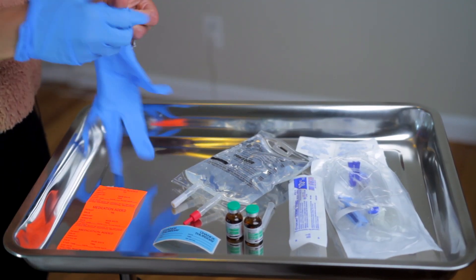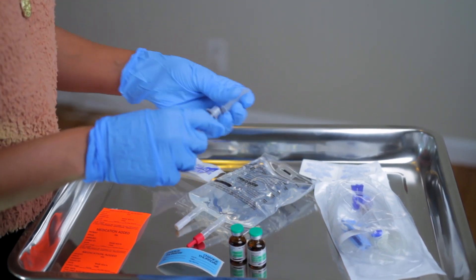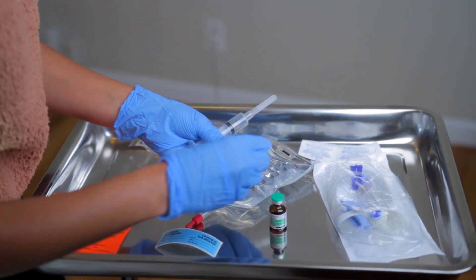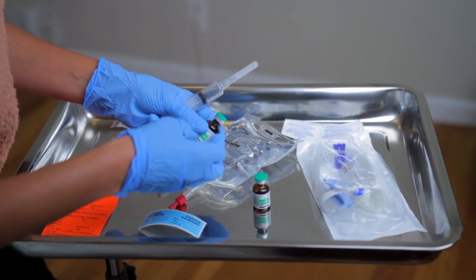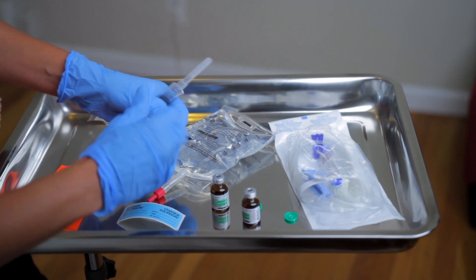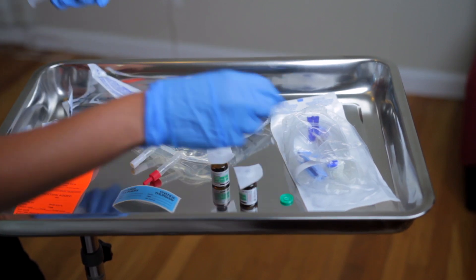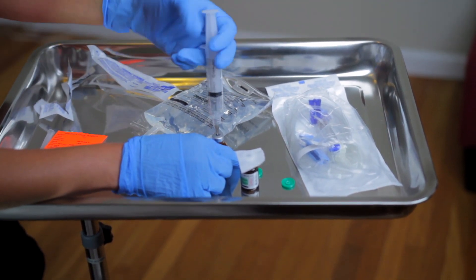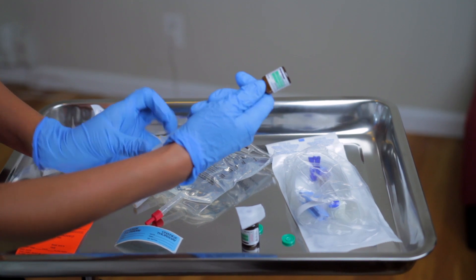I've already washed my hands and I have my gloves on. I'm going to open up my 10cc syringe and attach my needle. I'll open up both vials and verify that it's the right one — levofed, norepinephrine, four milligrams per four mils. I'll open up vial one and vial two, then open up the alcohol prep and put an alcohol prep on each one. I'll take off the first alcohol prep, inject in, put the air in, turn it over, and withdraw.